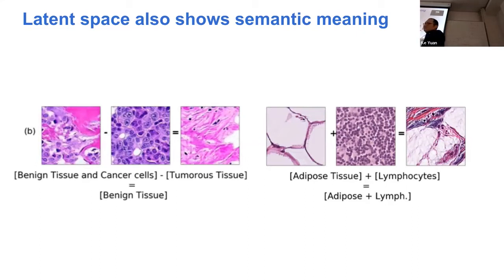Another thing I want to ask is, from this demonstration, assume that you can add it and it results in something meaningful. What does it say about the separation of the manifold? How much is the meaningful content decoupled in this model? For example, we have stroma center, and then we have lymphocyte center, and then epithelial isolate like that. How does your latent space say about their separation?